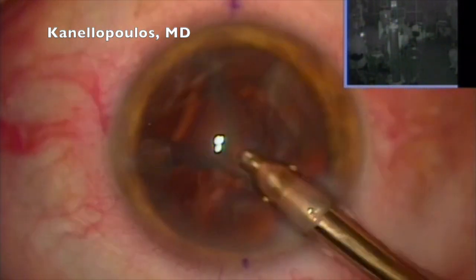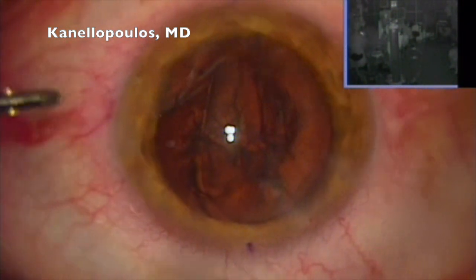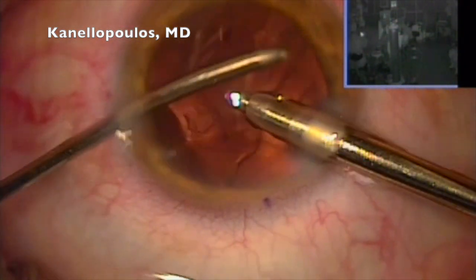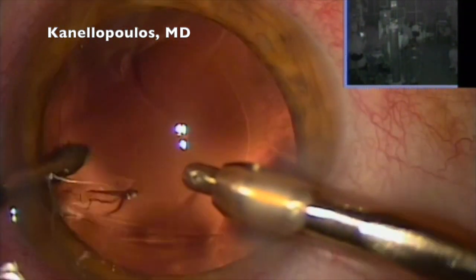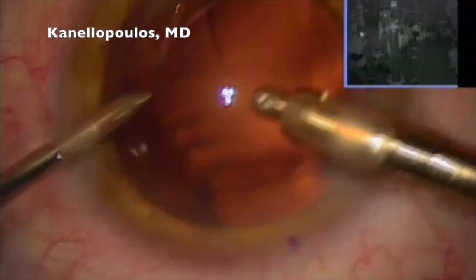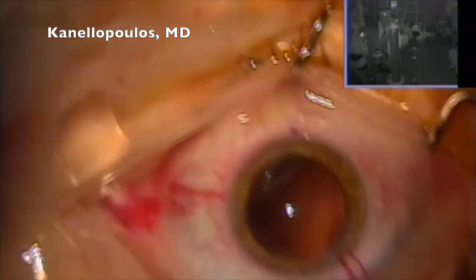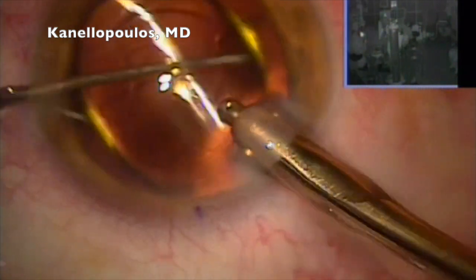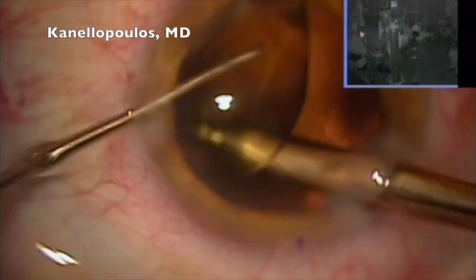Nucleus is out, we're coming in to remove the cortex here, and I was saying that for the non-dominant eye, we're aiming mainly somewhere towards -0.75, again with full astigmatic correction. I'm a big believer of this, and we're getting data that are comparable, if not better, than with EDOF and very close to trifocal lenses without any of the problems with quality of vision and contrast sensitivity that those lenses have. So again, under the lens, over the lens, remove the viscoelastic.